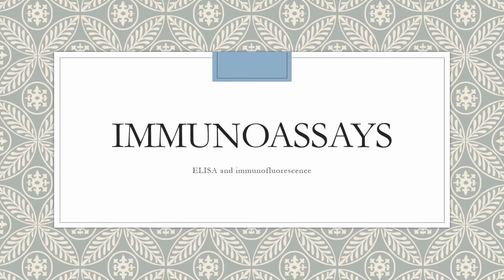Hi group, today we're going to talk about immunoassays. These are methods used to look for antigens or antibodies, and we can use them to help diagnose things like measles, mumps, HIV, hepatitis B, West Nile, avian influenza, and all kinds of diseases. We can also look for antibodies in patients' serum.